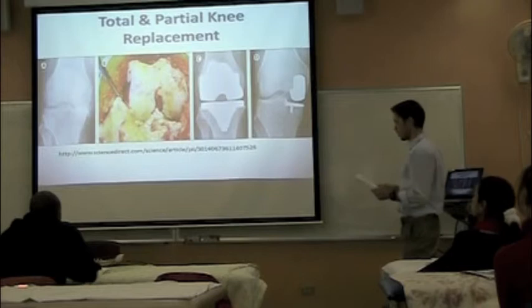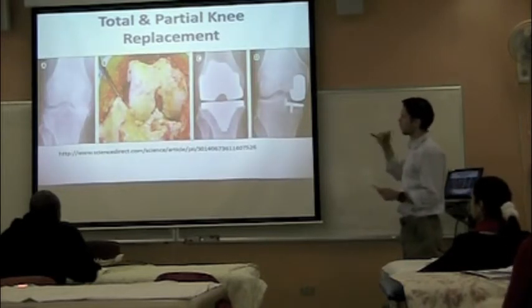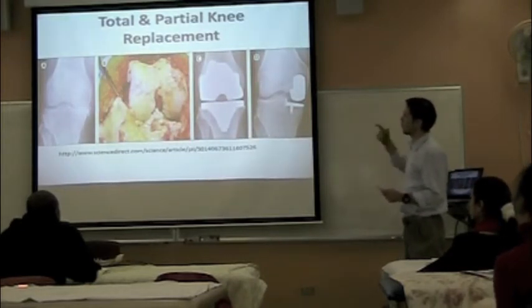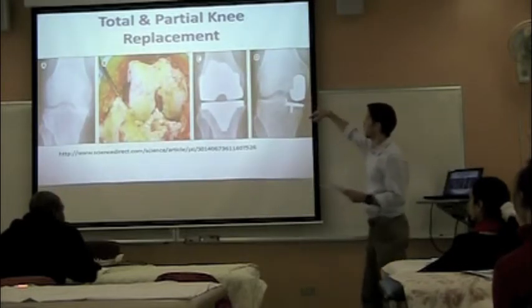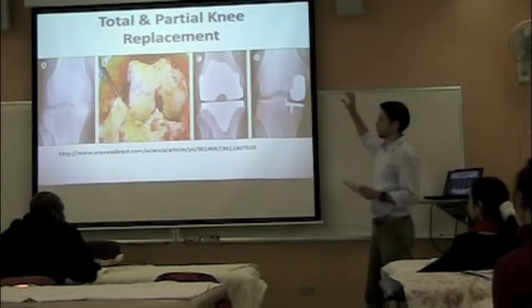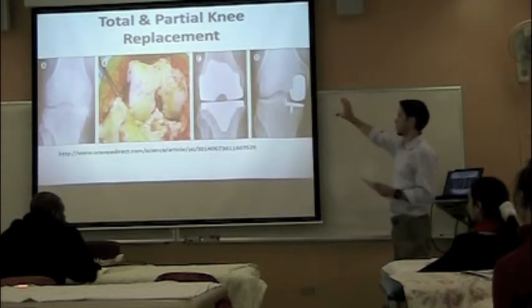We have a total knee replacement, which is the gold standard for this, but we also have partial knee replacements, where one of the three components, either lateral, medial, or the actual patellar surface individually will receive a prosthesis alone.